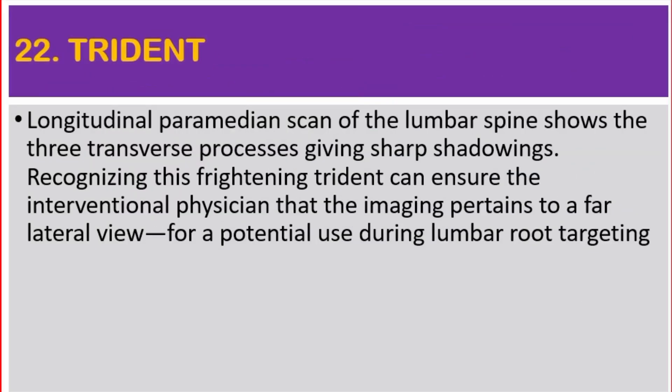Number 22: Trident. Longitudinal paramedian scan of the lumbar spine shows the three transverse processes giving sharp shadowings. Recognizing this frightening trident can ensure the interventional physician that the imaging pertains to a far lateral view, for potential use during lumbar root targeting.